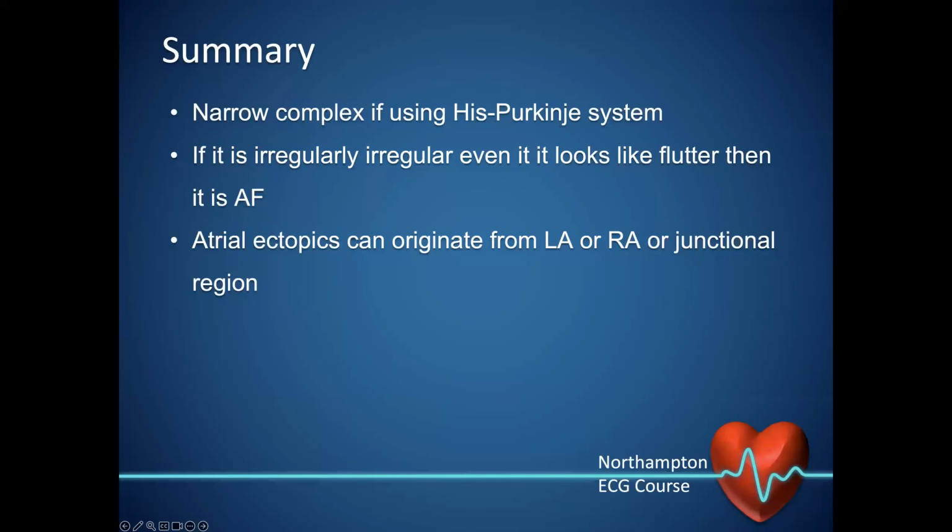So it was interesting you were talking about don't trust the EKG when looking at flutter. I don't know if you all have seen this before, but even looking at EGMs, you can really tell what's going on in the heart generally compared to an EKG because you have a lead inside each chamber. But sometimes when you're in the appendage, I feel like I've seen it where it looks very organized, but it still is a fib. So you end up with some degree of organization.